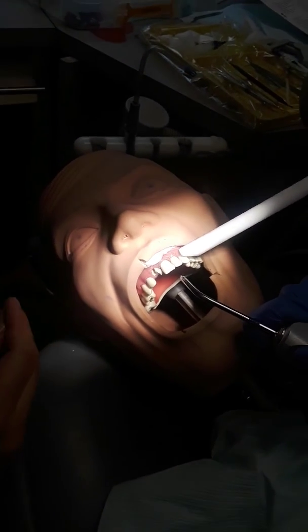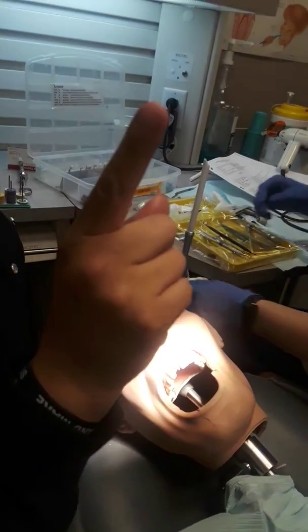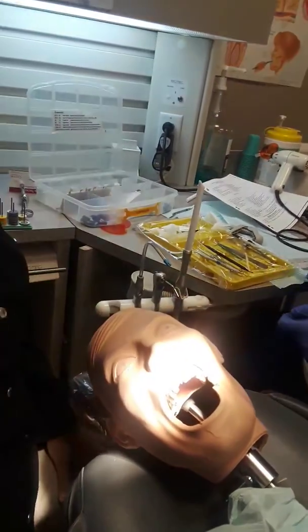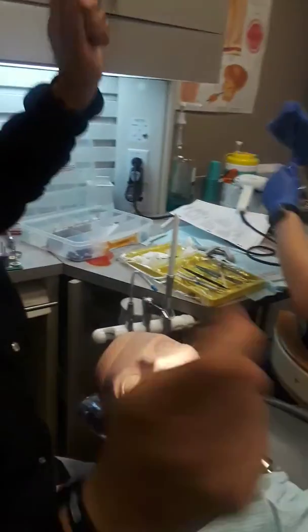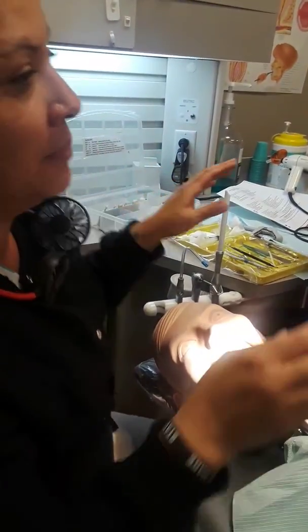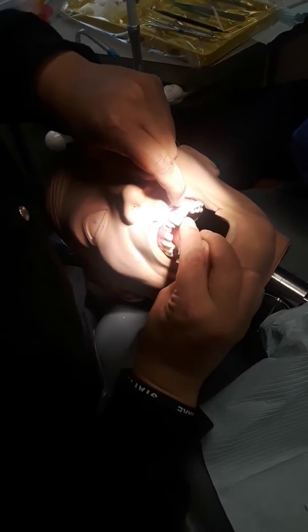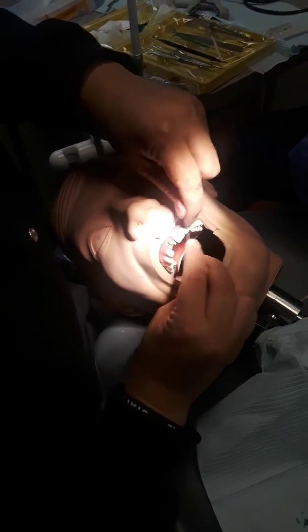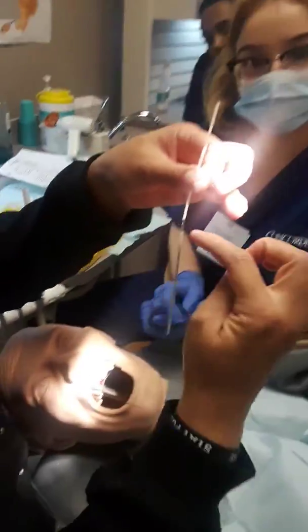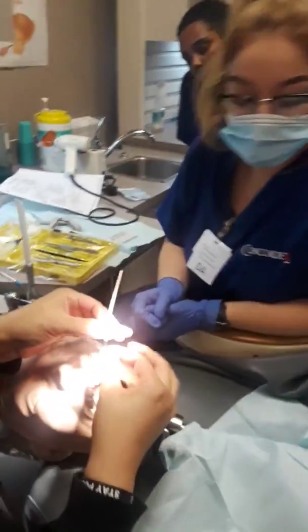Next step: pass finishing strip. But before you pass that, pass floss first — if my floss shreds, I'll use the finishing strip. If it's too tight, I'll use the finishing strip. But if floss goes in and out easily, I don't need the finishing strip. Check with floss — nice contact. But let's do the finishing strip so you know how to use it.